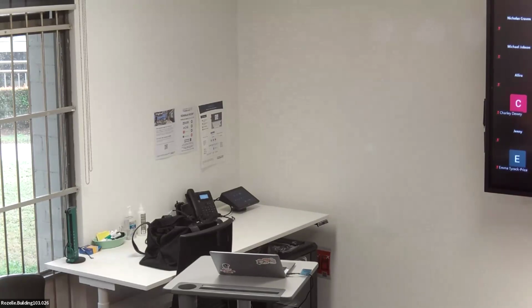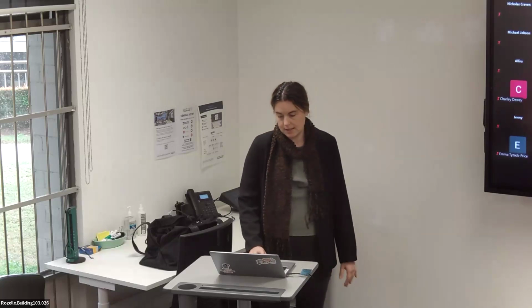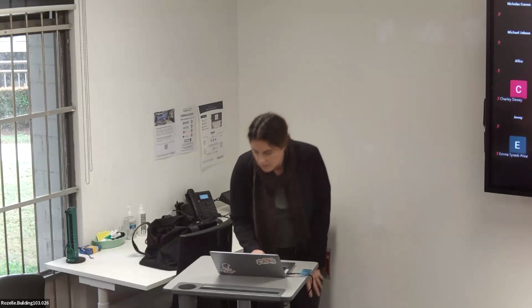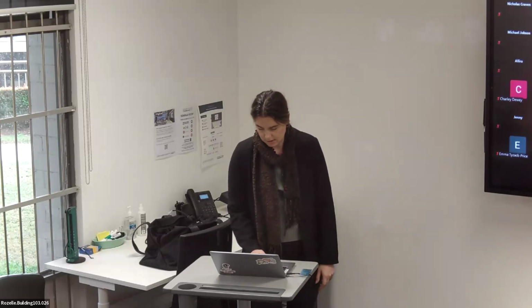Aside from that, there's a few questions I just saw on the Padlet, which Anita and I might try and filter while we're going through the tute throughout today. Is there anything else before we get started in general about the plan? No. All right, so to start off with, we might just pick up the first ECG and go through that one as a group, which should be a good way to start off today.